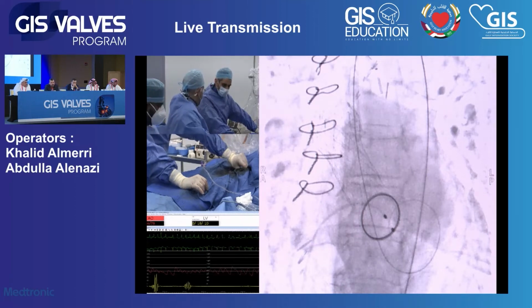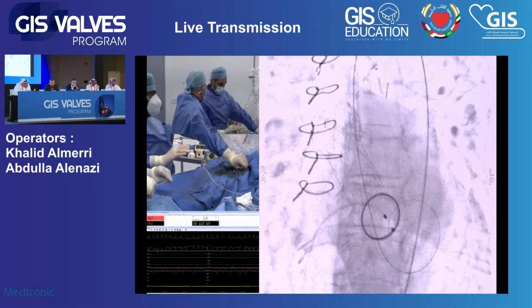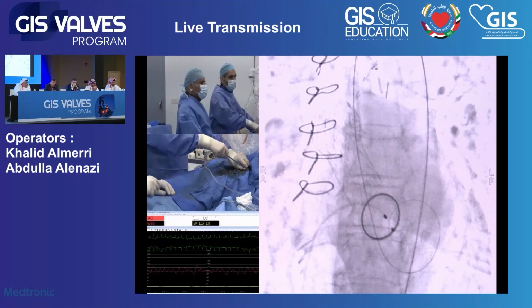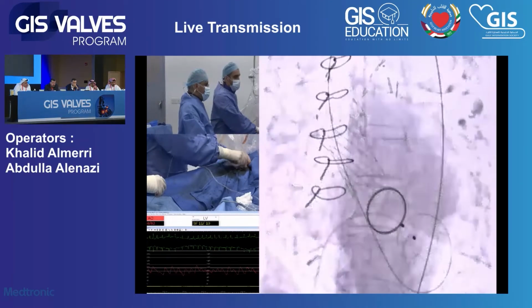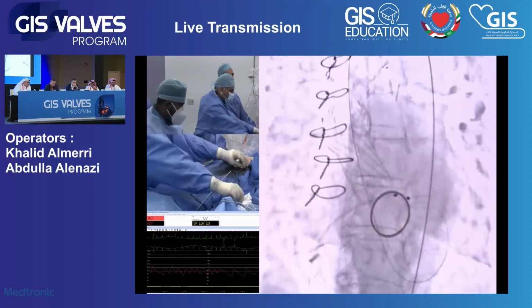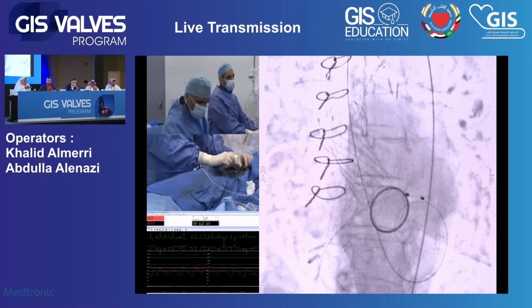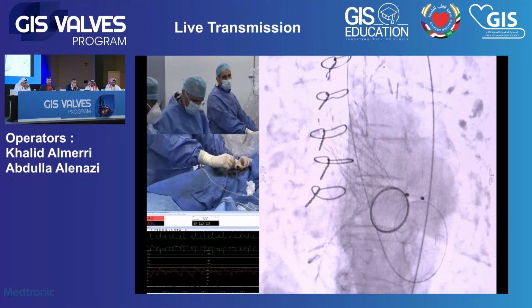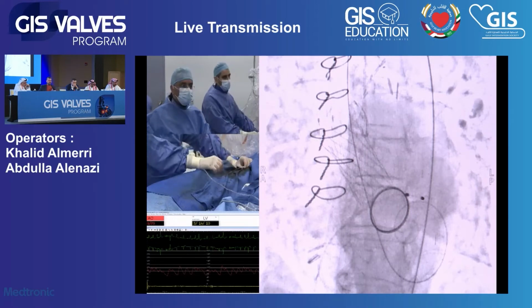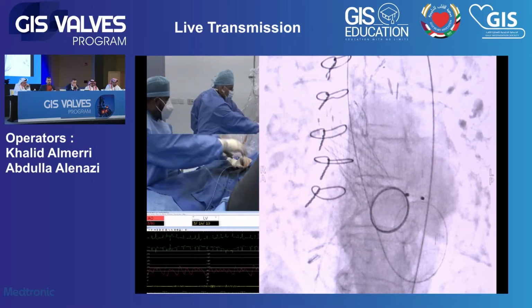What's the height from the mechanical valve at which you would start to be concerned, and why? We think the self-expandable is better than the balloon expandable. So usually if the distance is less than 6 millimeters, we start to worry about interacting with the mechanical valve. And if it's less than 6, we can say self-expandable, because you can position it more accurately. So with the balloon expandable, the balloon extends beyond the valve, and you cannot be 100% sure how much shortening you get from the valve below. So you might get a cut or get stuck with the mechanical valve and cause some bad complication. So in this case, we use self-expandable so we can deploy it more accurately, slowly, and make sure we are not interacting with the mechanical valve.